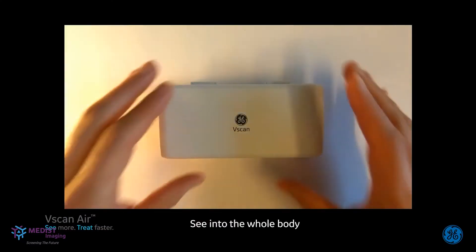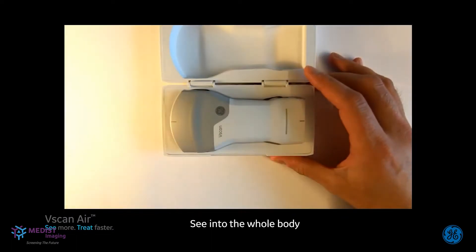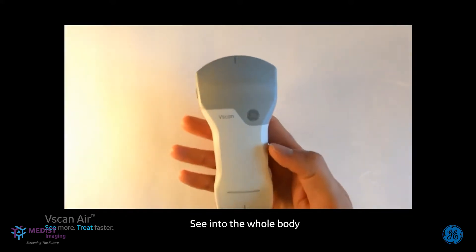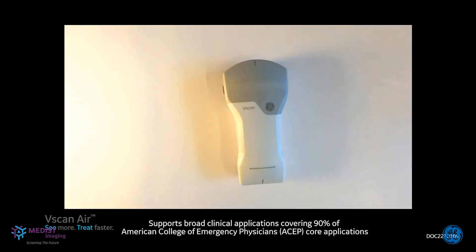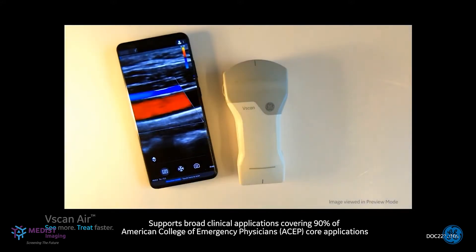With the V-Scan Air, we put handheld ultrasound in the hands of a broad mix of medical specialties, allowing you to see into the whole body with a simple flip of our industry-leading two-sided probe design. It connects wirelessly to your personal device, and with its convex and high-frequency linear transducer combination, supports you in quickly ruling in or out certain conditions to accelerate treatment decisions at the point of care.